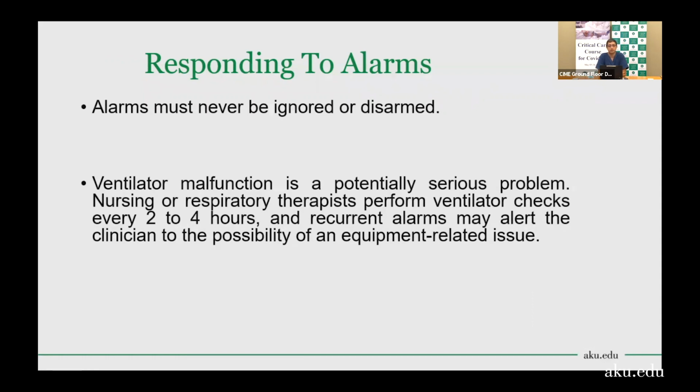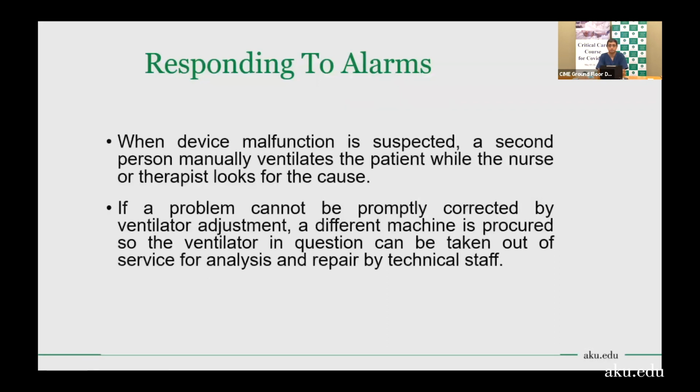And if there is an alarm which is happening recurrently, it should alert the clinician to the possibility of an equipment-related issue or a patient-related issue. So please note that it is not always the machine which is at fault. There may be some problem with the patient as well.